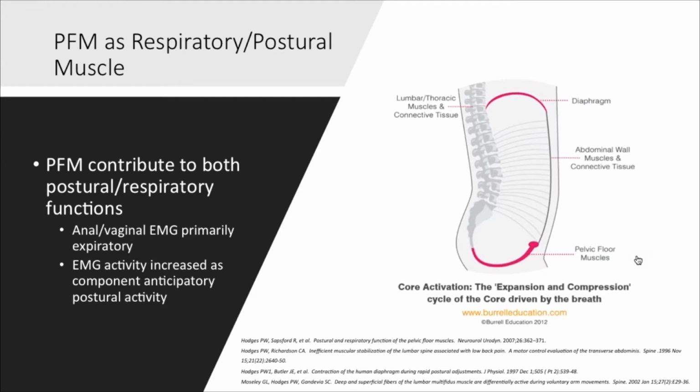And if we have patients that do have overactivity of the pelvic floor, this can be a great mechanism not only to assess, like Megan mentioned, we can take a look at breath patterns and whether we have movement of the pelvic floor, but we can use breathing, which we do 21,000 times a day, to access the pelvic floor and change breath patterns throughout the day to potentially get an influence on that overactivity.